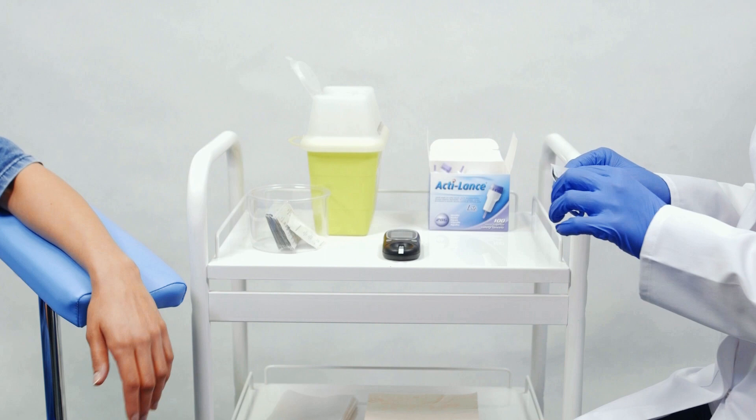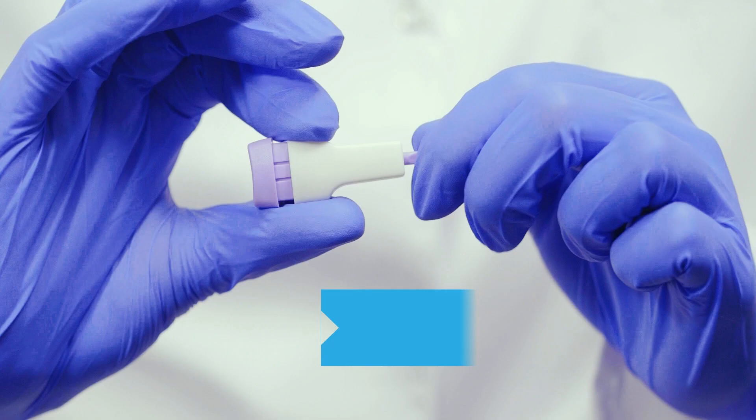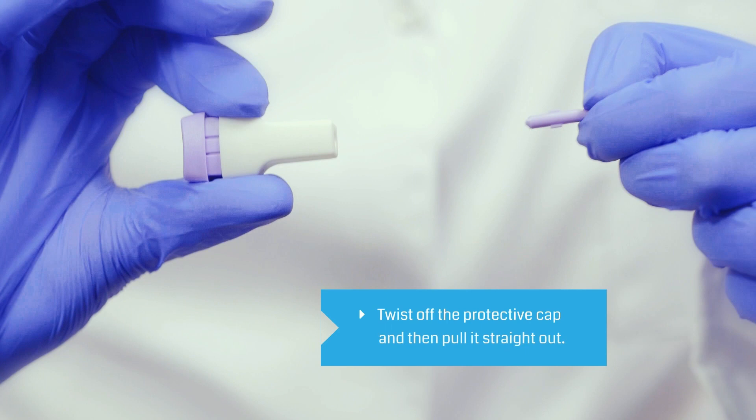Prepare the finger by cleaning it with a sterile swab. Carefully twist off the protective cap and then pull it straight out.